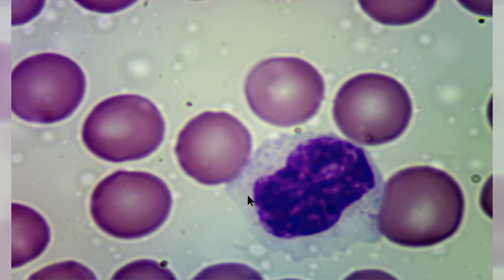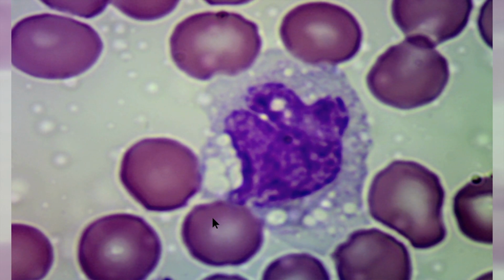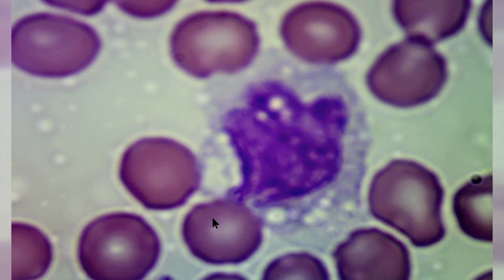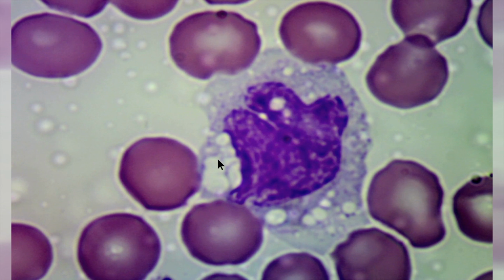and these are just general characteristics. The grayish, bluish cytoplasm, large size, and horseshoe shaped nucleus are characteristics of monocytes. You do see another monocyte in this case. You can see the size. This monocyte is very actively phagocytosing, and you can see the presence of the phagosomes in here. You can see the shape and appearance of the cytoplasm is quite unique.